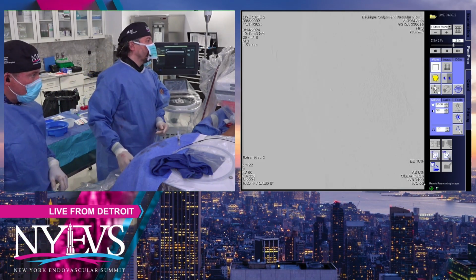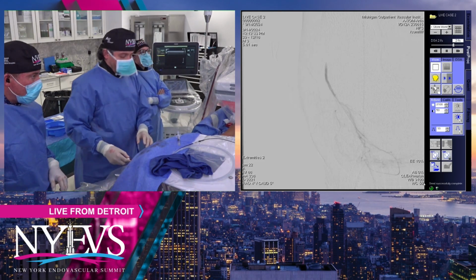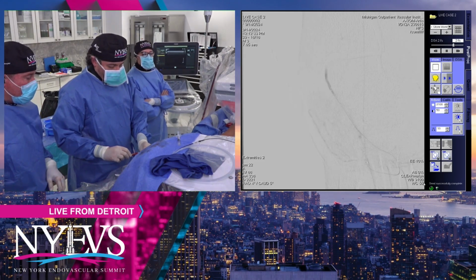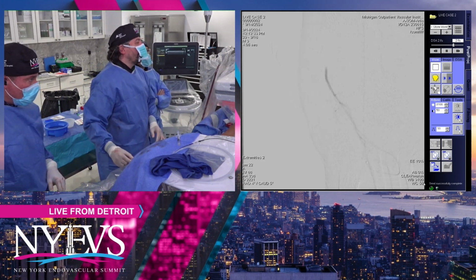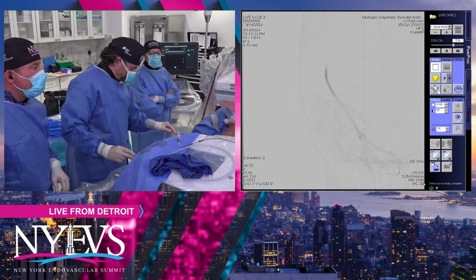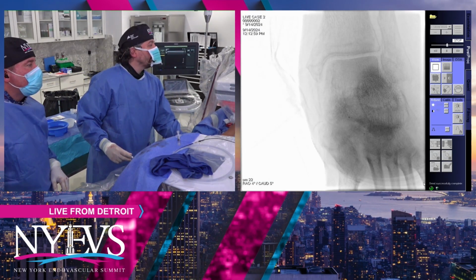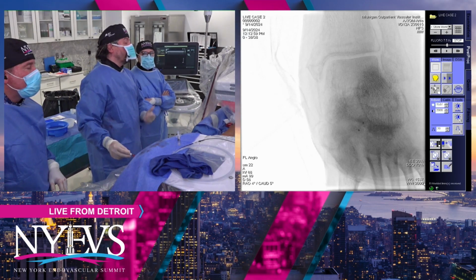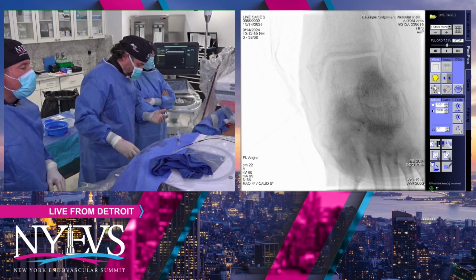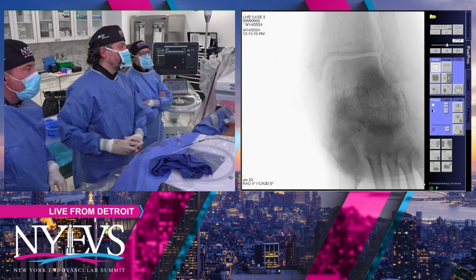So this is disappointing because I was hoping to see some calcaneal branches, and I am not. So let's see. One option, and I'm not going to do that here today, but just for the sake of discussion, one option is always actually to go from the distal peroneal. That will be, in my opinion, a more aggressive approach, to try to connect to the lateral plantar artery.